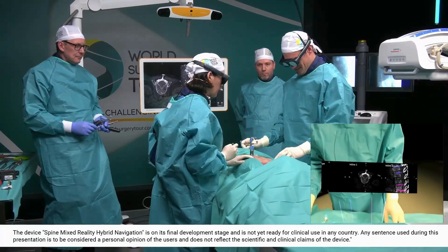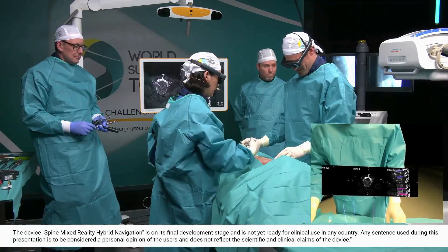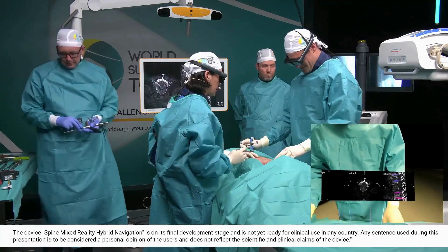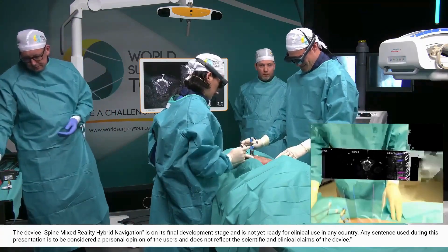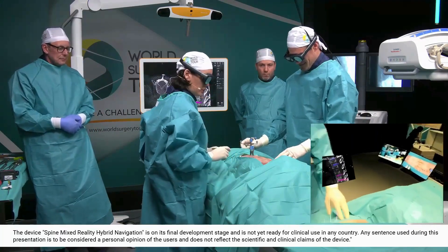If I turn my head a little bit upwards, the 3D image just vanishes and I can see the skin. I think this is quite practical to do it like this. Otherwise there is a device that you can use.